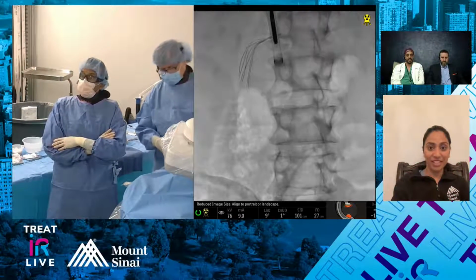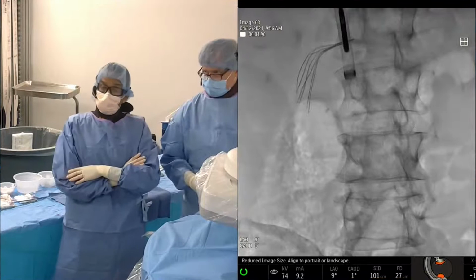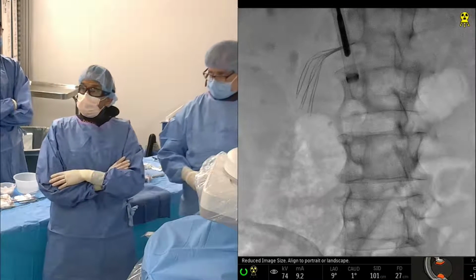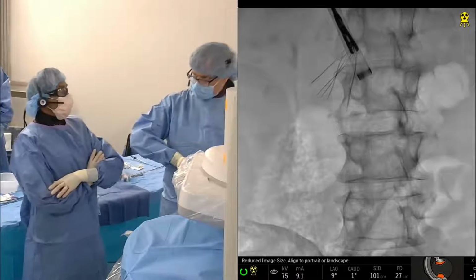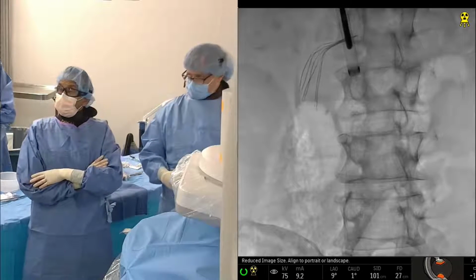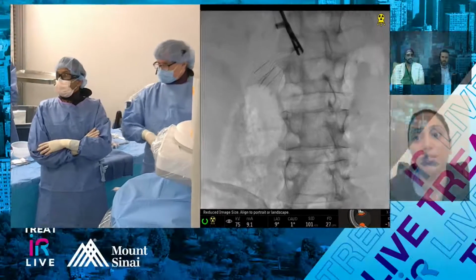So one of our options here is to just pull. I don't think that's a good idea. No, it's not a great idea. I just think it might push out, and then lower, grab the apex and straighten it out. Now that it's come out, let's just see here.